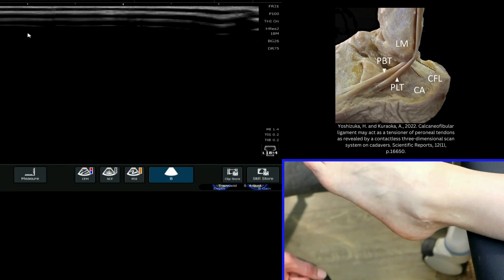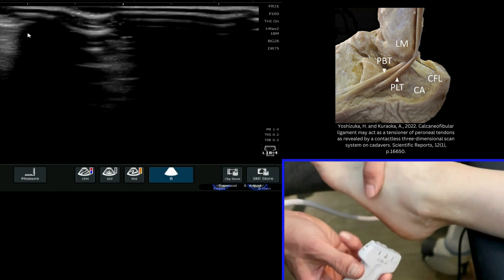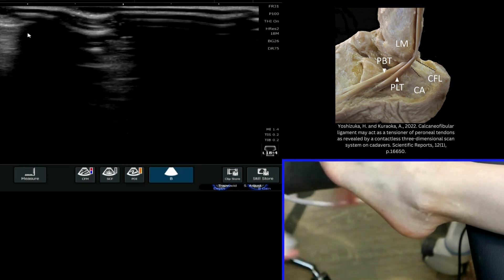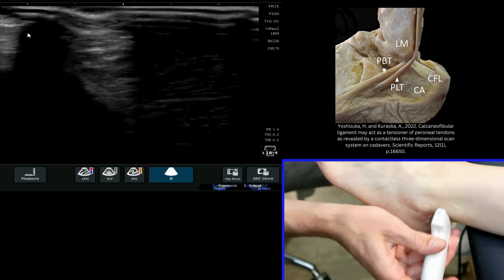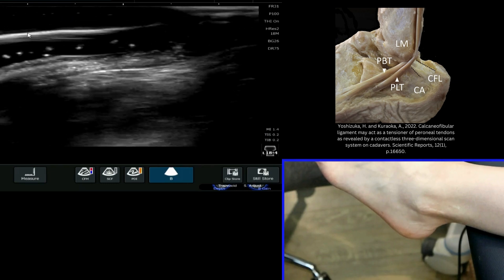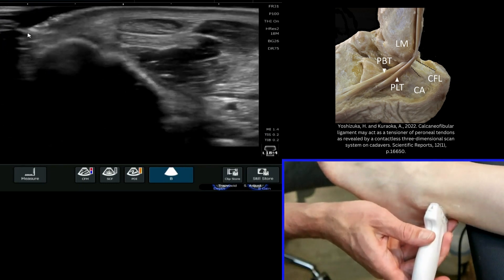If we have a little look with our ultrasound probe — I often look at the calcaneo-fibular ligament in this position, not in prone. Part of the reason for that is that I feel I can dynamically evaluate this ligament more effectively. Bringing in dynamic evaluation of ligaments certainly helps your diagnostic ability and your ability to make a conclusion.